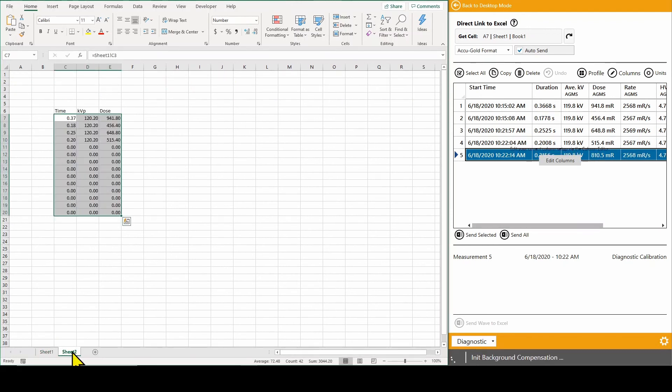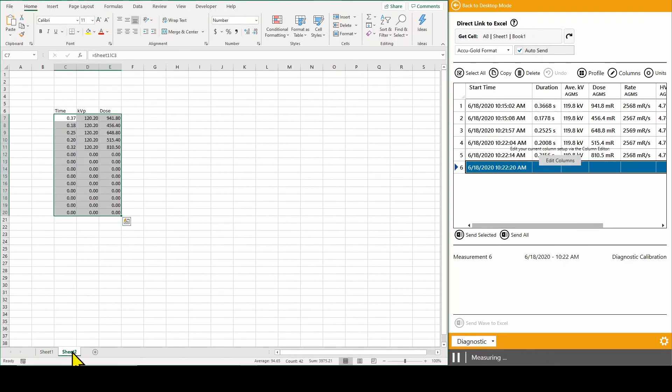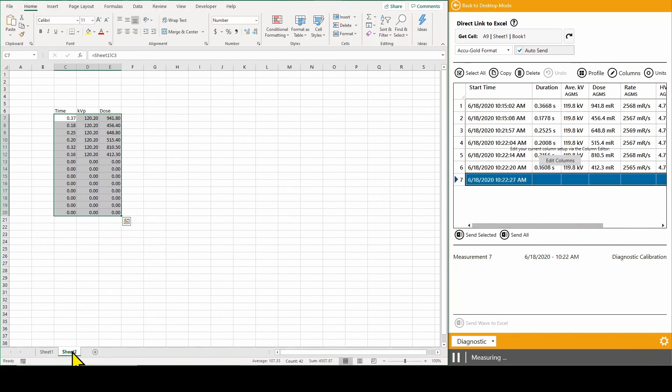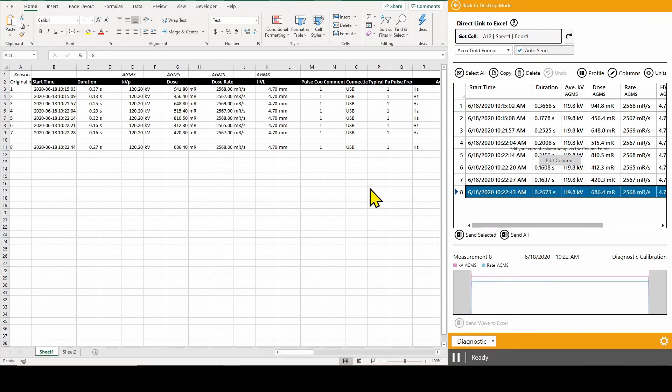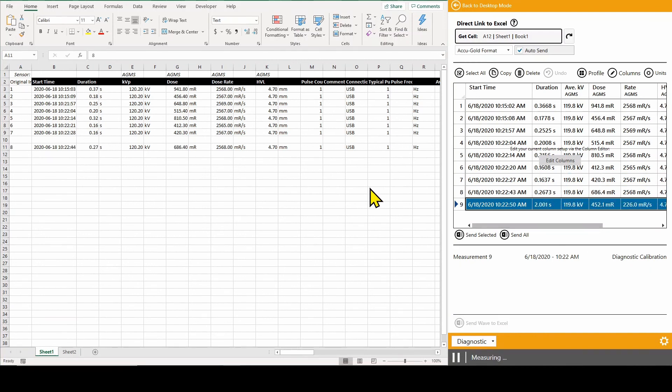If you would like to separate the measurements by test section, you can use the Get Cell button to reposition the output to a different row.